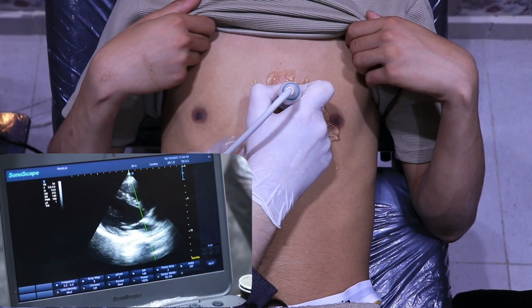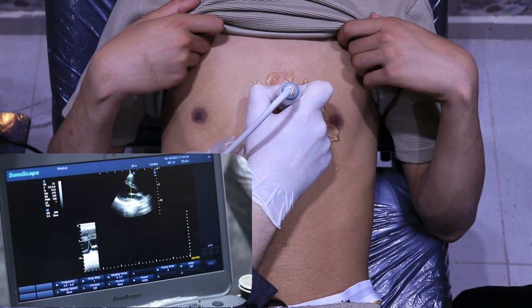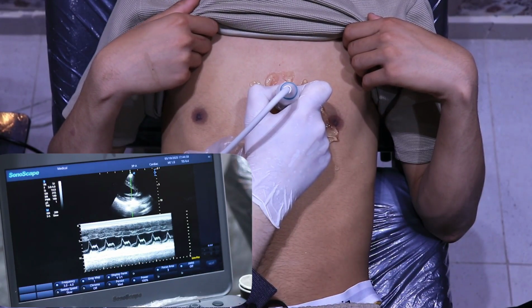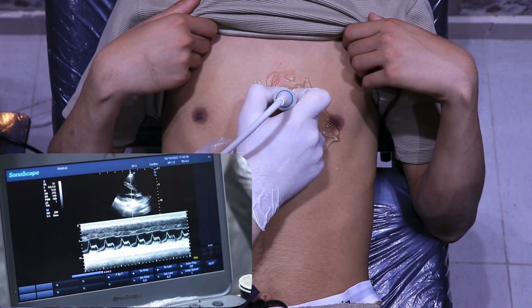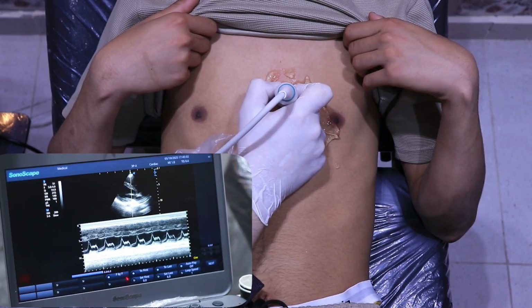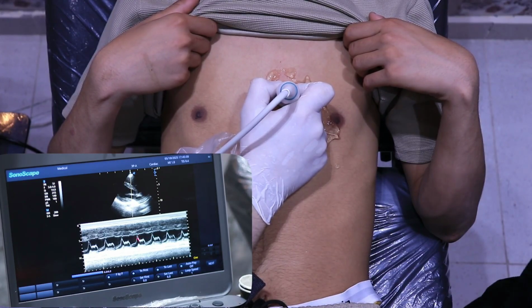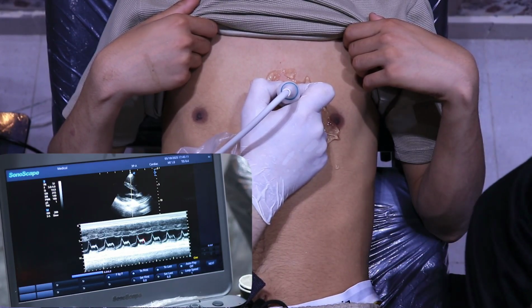Valve. We'll see the M mode of the mitral valve now. So we'll just update, and we can see the anterior leaflet and the posterior leaflet. The anterior leaflet is much better seen. This is the anterior leaflet and this is the posterior leaflet. The first wave is the E wave, and the second wave is the A wave.